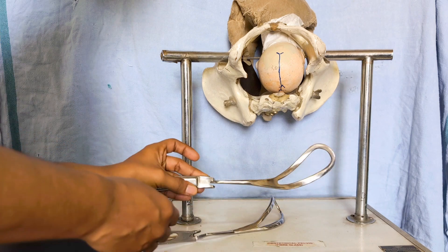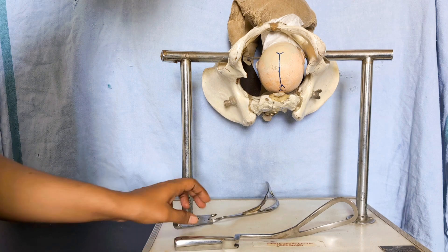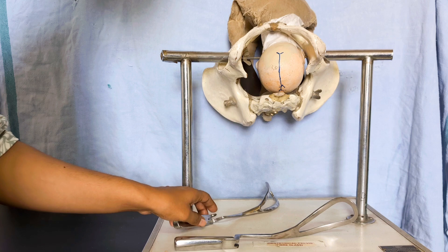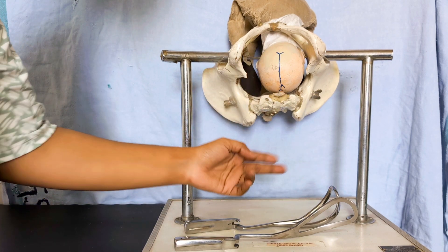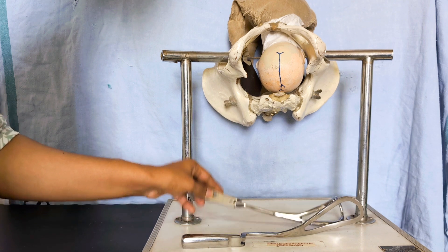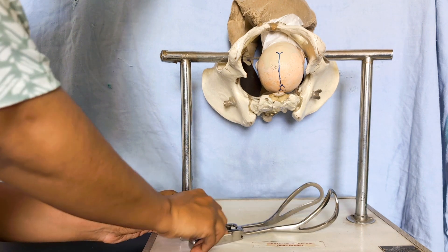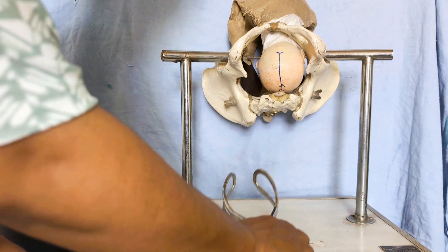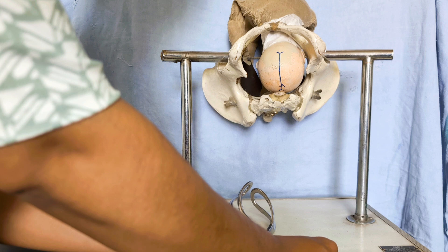Now assemble the forceps right in front of the patient's perineum so that you know which is the right and which is the left blade. Place them on a hard surface — handle, lock, shank, then blade — with the blade toe facing towards the ceiling. This is how you identify the left blade and the right blade; keep the right blade over the left.